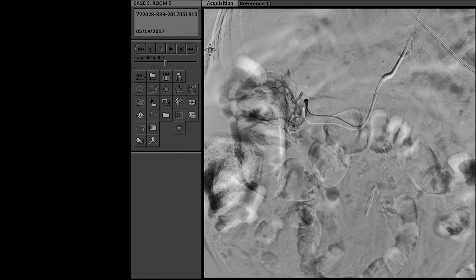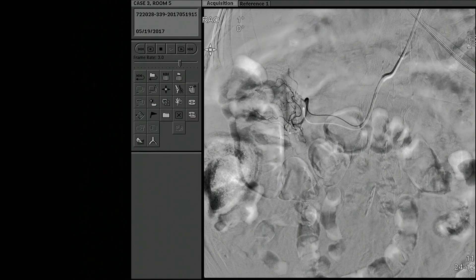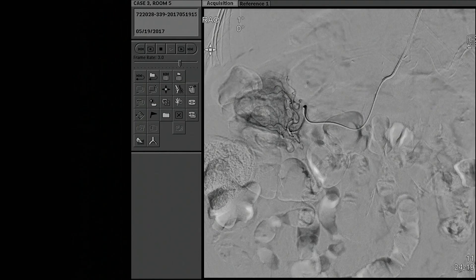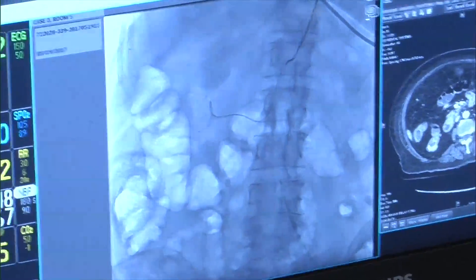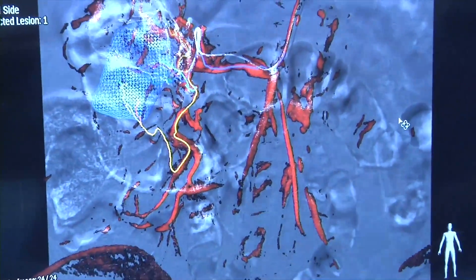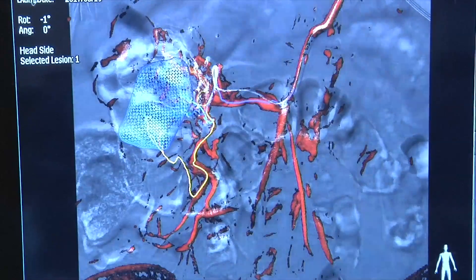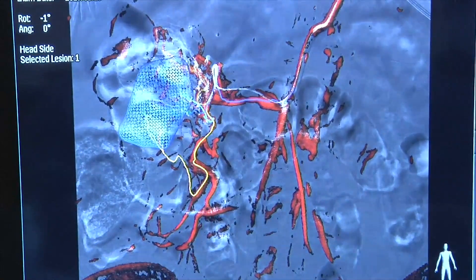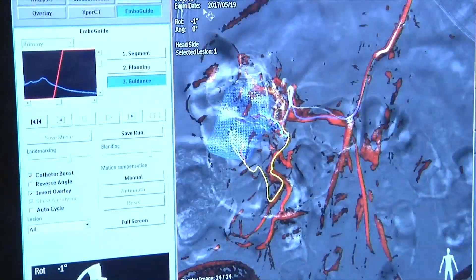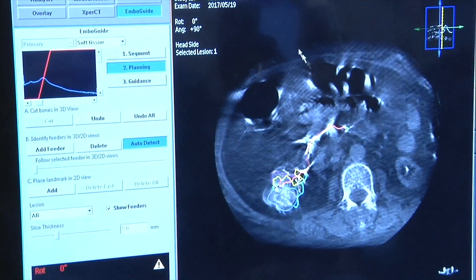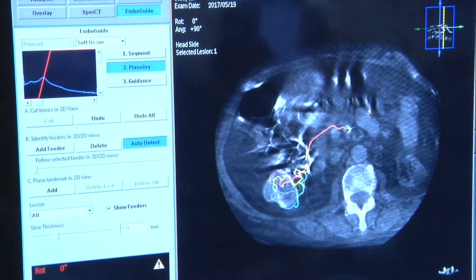Can you guys focus on that image on the bottom — the 3DRA? You can sort of see the territory there. It's going to end up being the light blue line that's going up to that area — that's the territory that's bleeding. You can see the volume and the territory that we picked here.